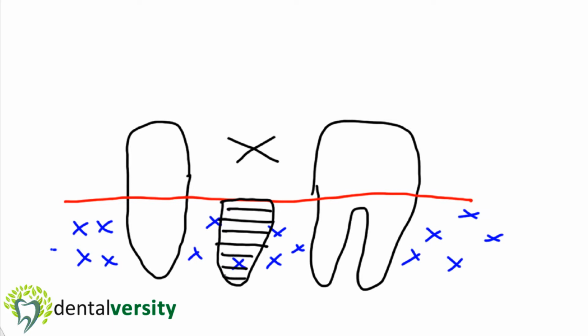So the implant is placed in the bone, and the great advantage, once it's healed and the bone has joined with the implant, is that it is going to keep the bone at that level. It'll help to prevent the bone from shrinking. So it actually preserves the height of the bone. And in addition to that, it's preserving the strength of the adjacent teeth as well.